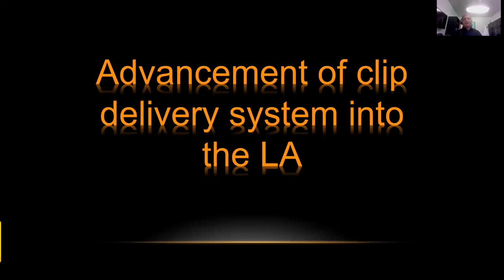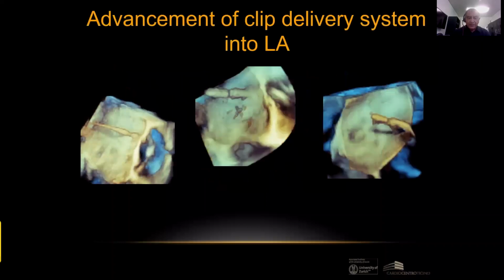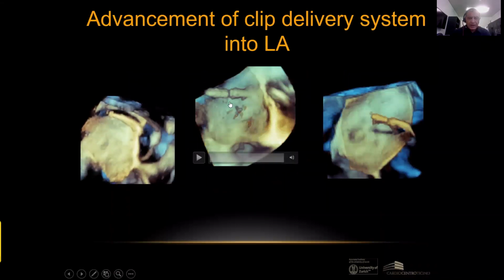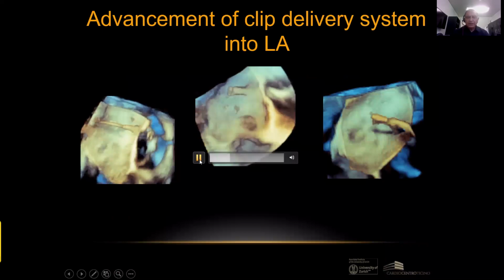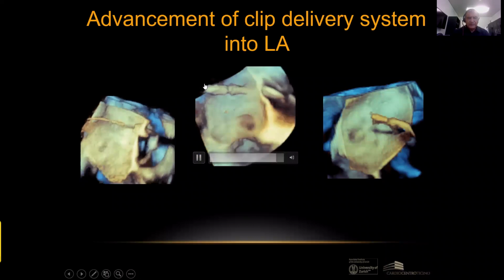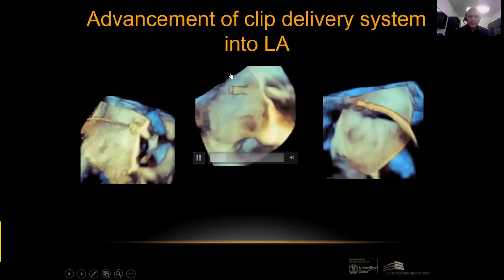Then the next step is the advancement of the clip delivery system into the left atrium. And then you can see here the delivery system. This is the guide wire, and this is the guide catheter here. And you can see the advancement of this guide catheter inside the left atrium. Then you can push out the clip. This is the catheter, and here you can see the clip that goes out.